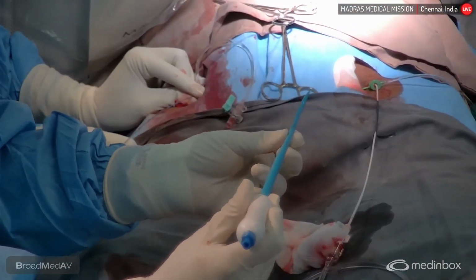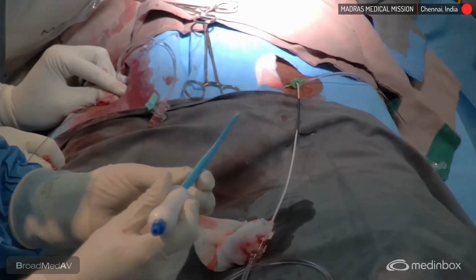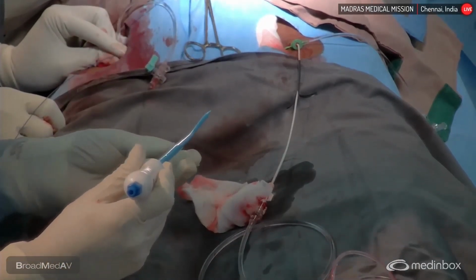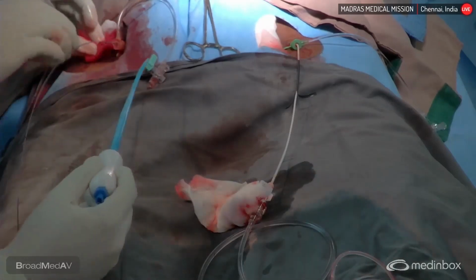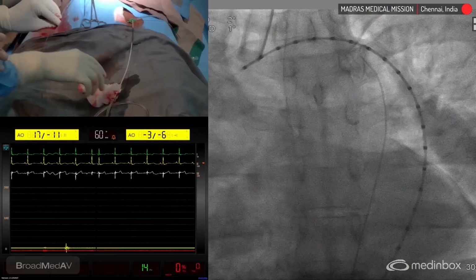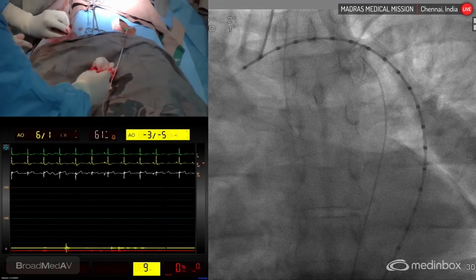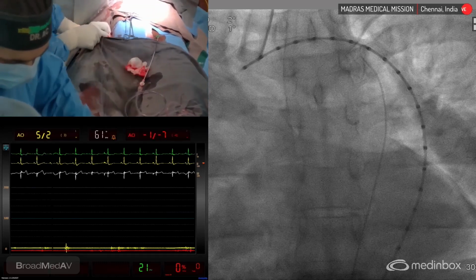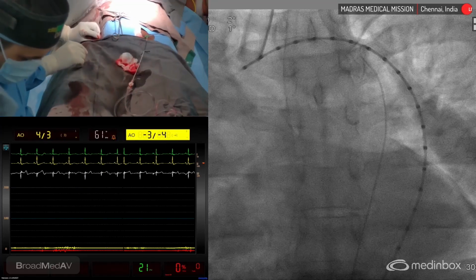So this progressive dilator, you can see it starts from 18 French here and till 24 or even 26, 27 you can dilate. Now suppose we are taking a 24 French device, maybe we can dilate it till 22 French and then take the device. So we have removed the sheath, we are giving groin compression, and now we are going to increase the aperture of the access by the progressive dilator.